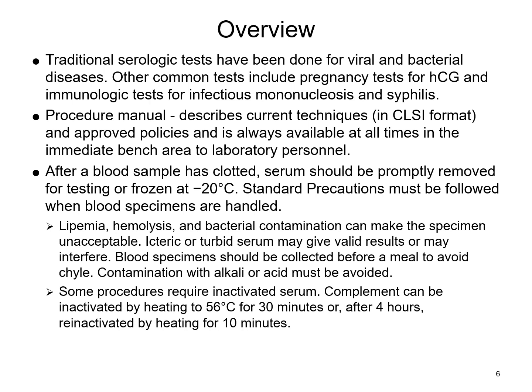Complement within body fluids can be inactivated by heating it for 30 minutes at 56 degrees Celsius. When more than 4 hours has elapsed since inactivation, a specimen can be re-inactivated by heating it to 56 degrees Celsius for 10 minutes.